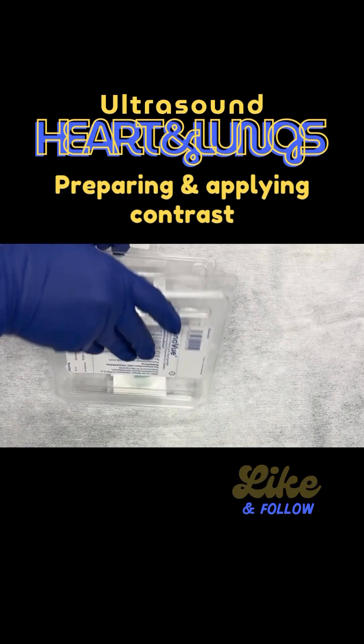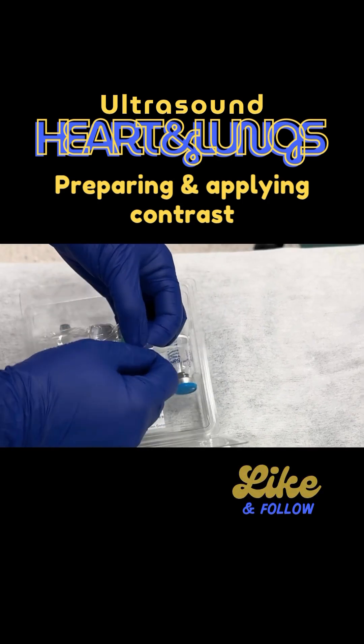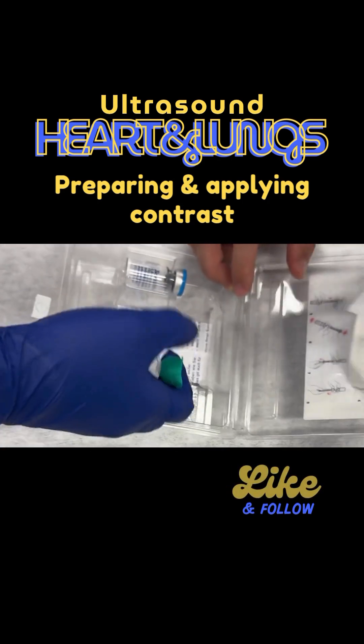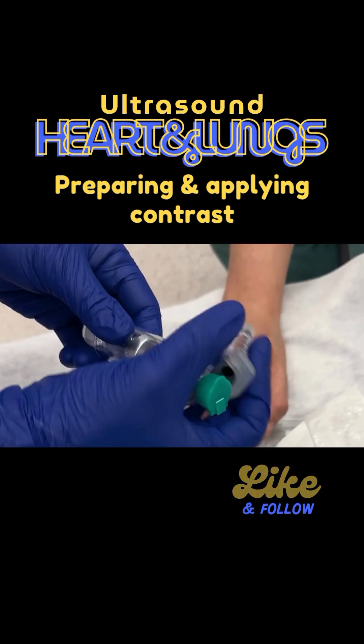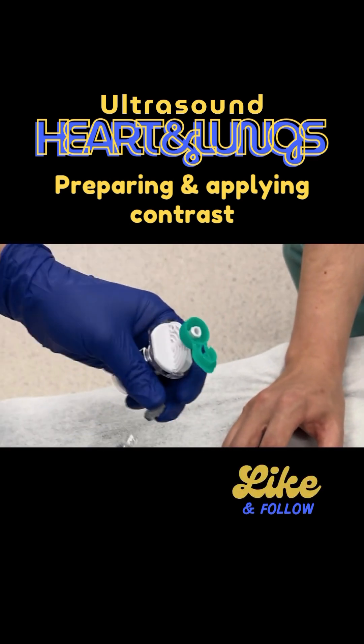For left ventricular contrast we open it. We have Sonovue here and you can see there are several components. The components need to be individually unpacked. You have the Sonovue per se, you have an adapter and you have sterile fluid, and you attach the adapter — you can see that you can open it.